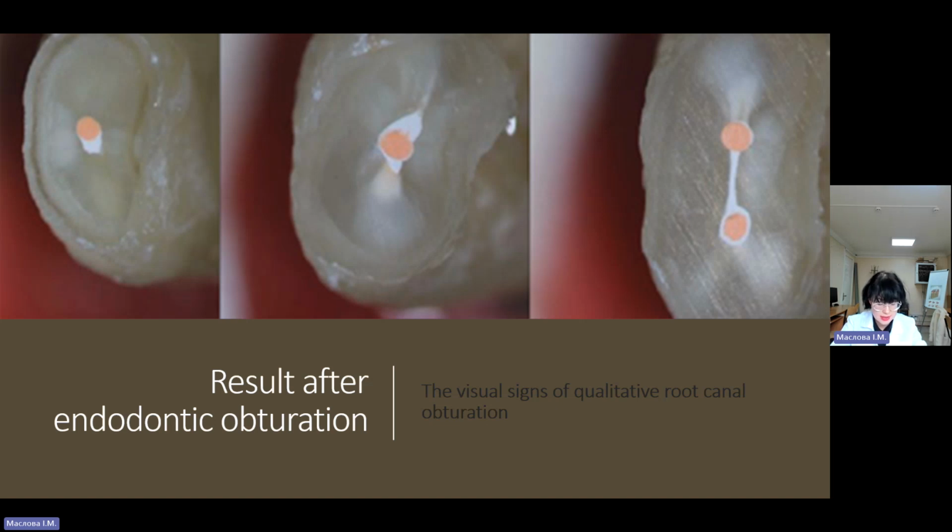Gutta-percha cones are now produced to match the taper of the canal prepared with the 0.04 or 0.06 rotary instrument. A large tapered gutta-percha cone can be used with either vertical compaction or lateral compaction. The matched taper single cone technique has been used for obturation of curved canals.